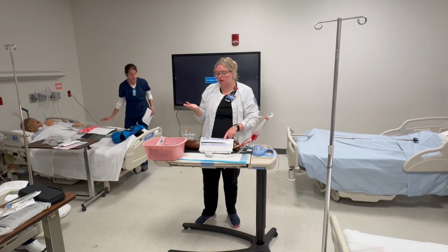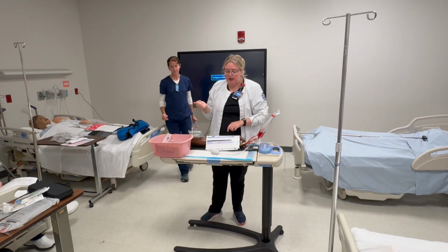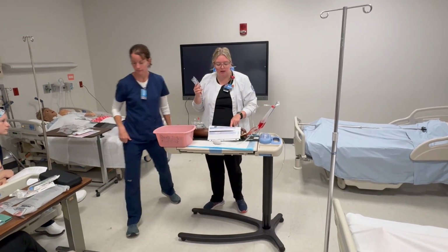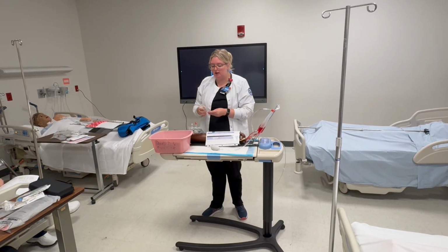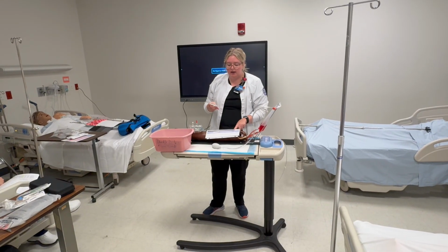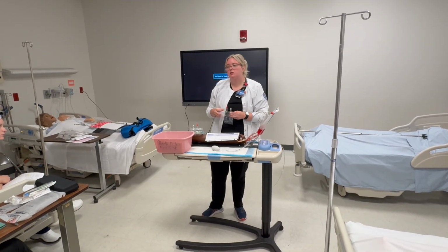This is 60 milligrams in a 50 ml bag. That's what my order says. My right route, which is IV piggyback. This is an IV piggyback. And my right time, which is now, and right reason, my patient has sepsis, and gentamicin is used to treat sepsis infections.